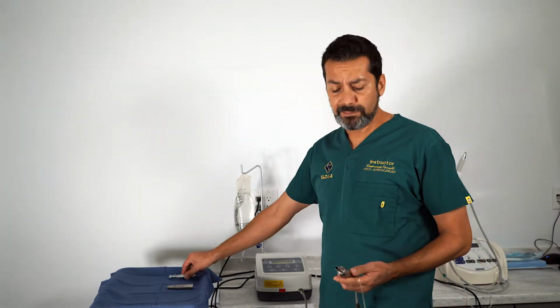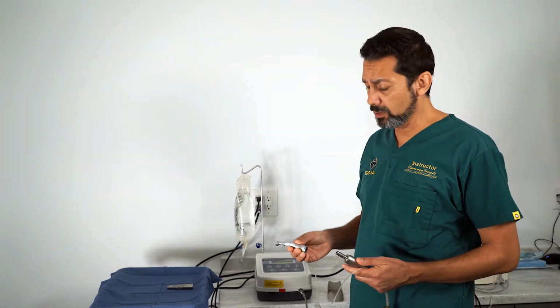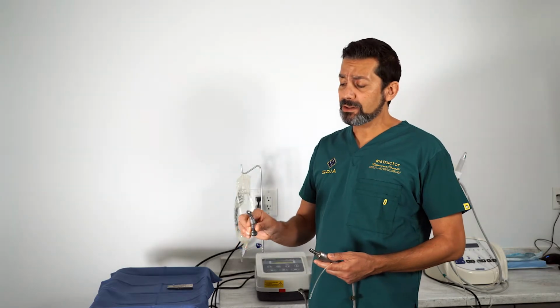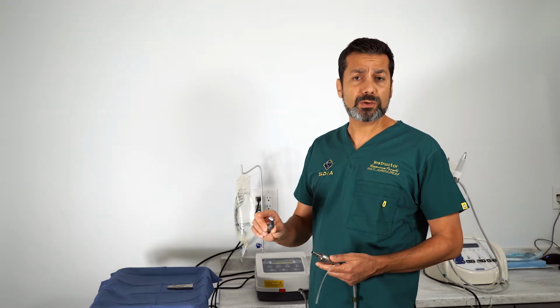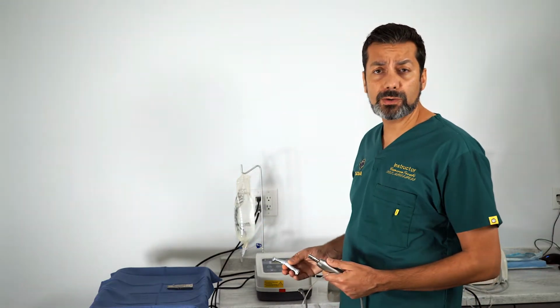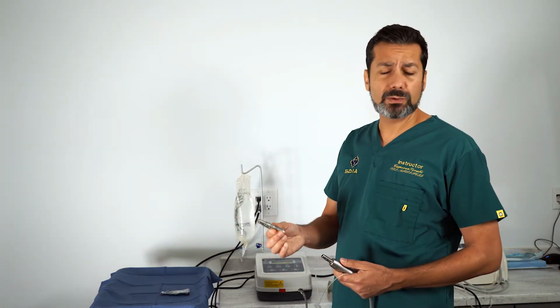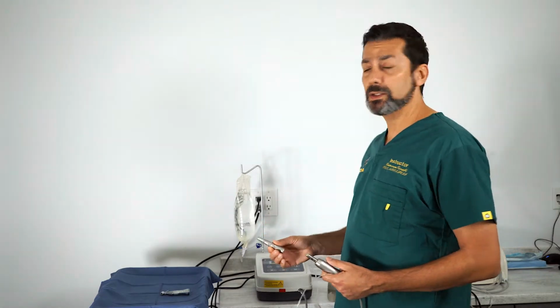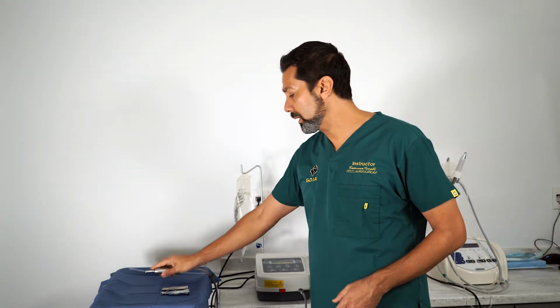Generally, you have two different attachments for this motor. You have your most used contra-angle, which is normally either a 32:1 ratio or a 20:1. Depending on which kind you buy, you will adjust your motor accordingly. You also have a straight handpiece that's usually used for bone reduction and whatnot, that are generally a 1:1, and then you will also adjust the ratio on the motor accordingly.